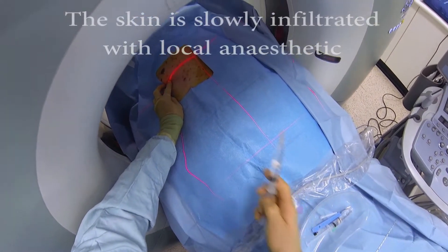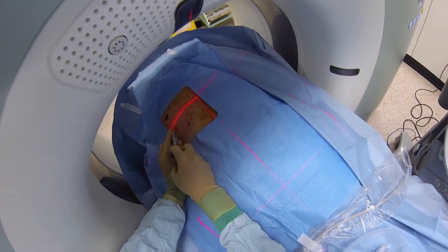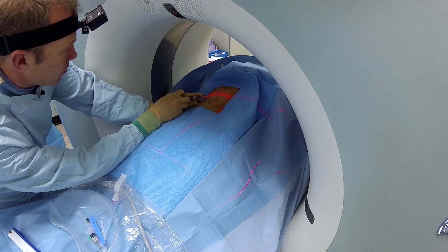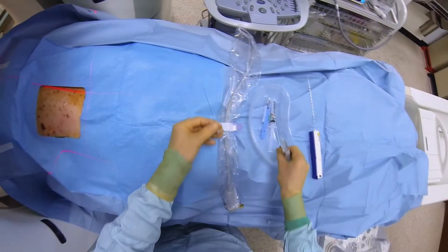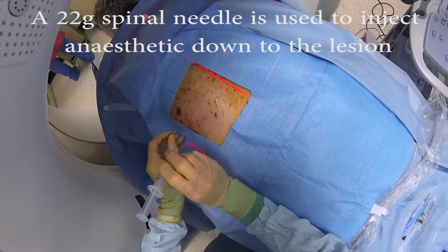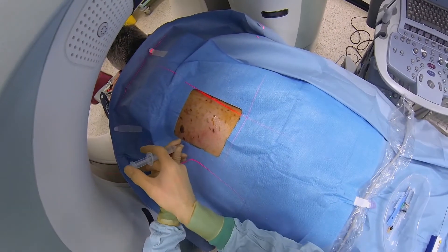I'm going to put some local anesthetic in now — this will be a little bit sharp, and it's going to sting a bit. Now we're going to go a little bit further in with this spinal needle, take us down towards the lesion, some more anesthetic.